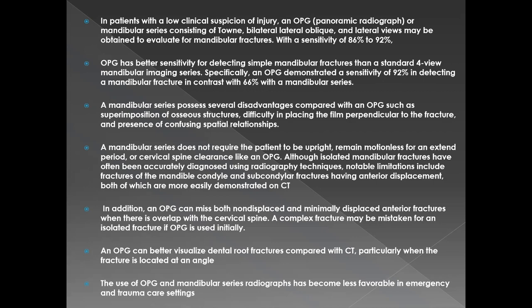But basically what you do is that you take an occlusal X-ray, all right? You put it between the teeth and the cheeks, between the buccal mucosa and the teeth, and then you ask the patient to inflate or puff up his cheeks or just blow up his mouth. Once they do that, air will come in between the teeth and the buccal mucosa, so the X-ray will become separated from these two. And then you can take a view of this parotid duct like that.